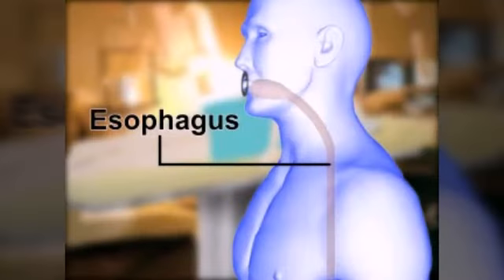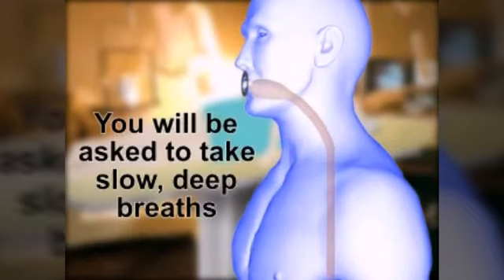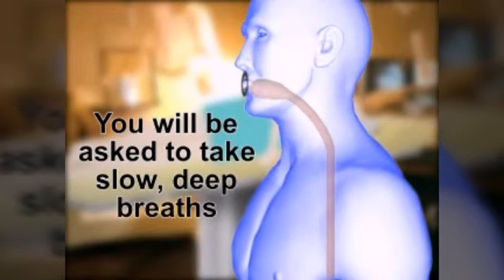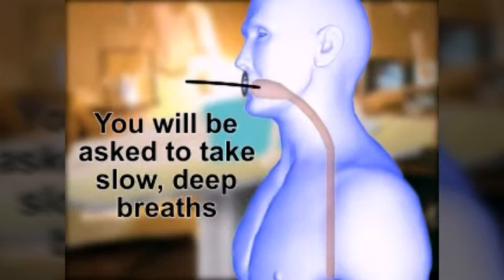Esophagus or food pipe. In order to help relax the muscles in the back of your throat and help open up the passageway, you will need to take slow, deep breaths. You will then be instructed to put your chin to your chest and open your mouth. As the doctor begins to push the tube in, you will be asked to swallow. Swallowing makes the tube go down more easily.